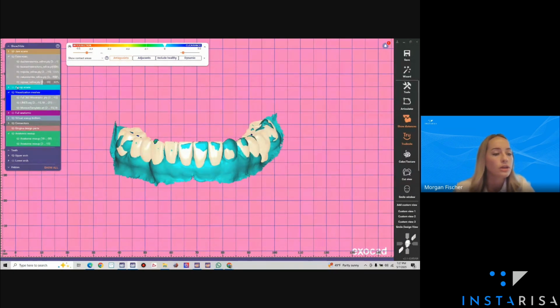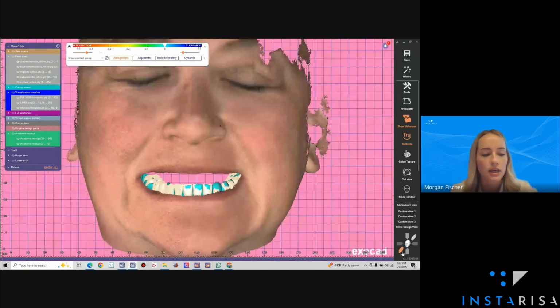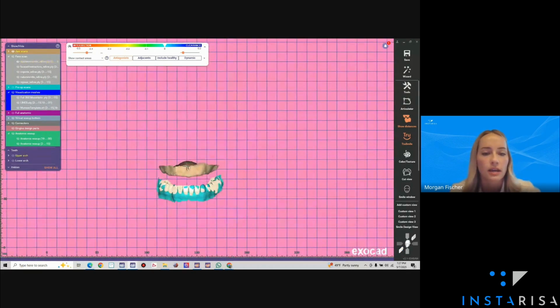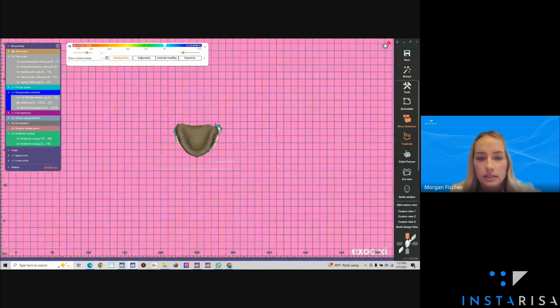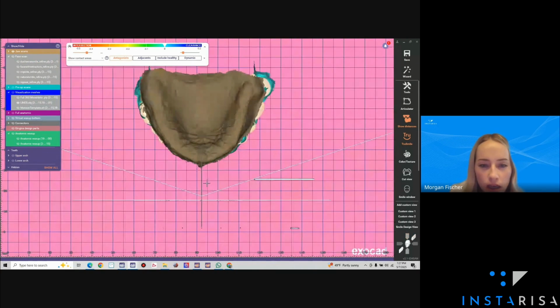Another thing that I'm looking for here, so there's about 10 different steps that I go through when I'm looking for a smile design. Like I said, first and foremost, we're starting with the midline. Another thing I'm looking at is just to make sure that everything is aligned properly. When I'm turning these lines on, I like to look at it from the top here and see this line right here, just going right down that incisive papilla through that mid-palatal suture.